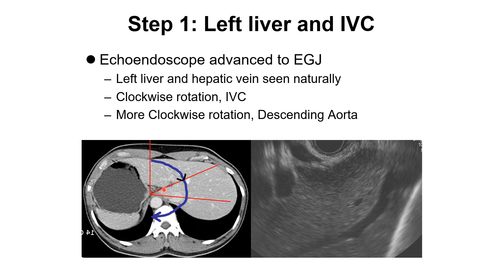This is the left liver on CT. We can understand each organ and vessel according to the scope rotations. With clockwise rotation, the hepatic vein and IVC can be seen. With more rotation, we can see the aorta, and then we can find the pancreas area.